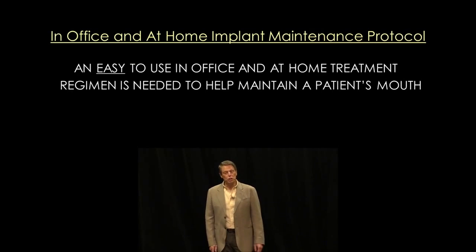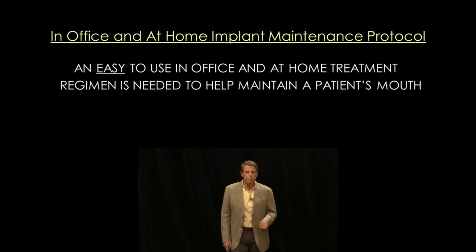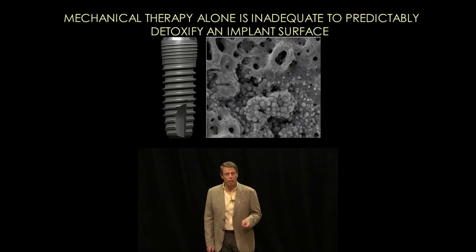Hi, my name is Paul Fletcher. I'm a periodontist and a member of Specialized Dentistry of New York. And what I'd like to do is present an evidence-based, in-office and at-home treatment regimen for the maintenance of dental implants. Because of the macroanatomy of the dental implant threads and the microanatomy of the dental implant surface, mechanical therapy alone is inadequate to predictably detoxify an implant surface.